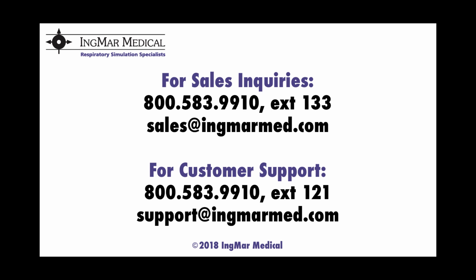The answer is yes. Every time an ASL 5000 is purchased, a router does come with the ASL 5000. You would simply connect the router to the ASL 5000 itself, and then you would connect to that router wirelessly as you would any Wi-Fi in an airport or in a coffee shop, and connect directly to that router, which the router name would be labeled on the outside of the router.